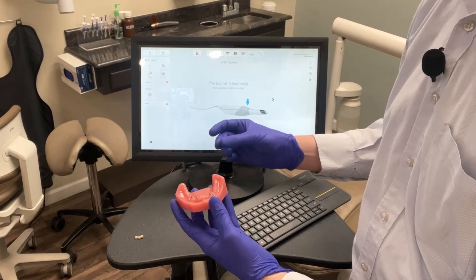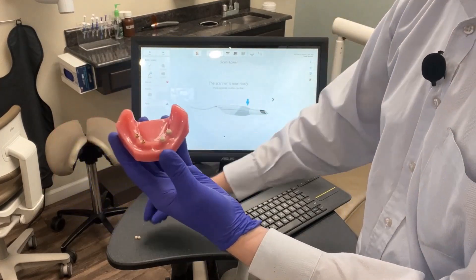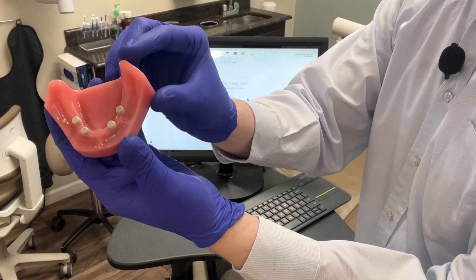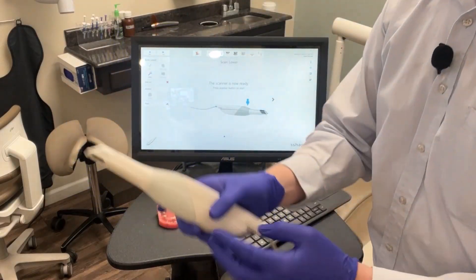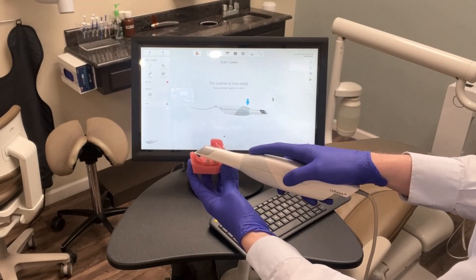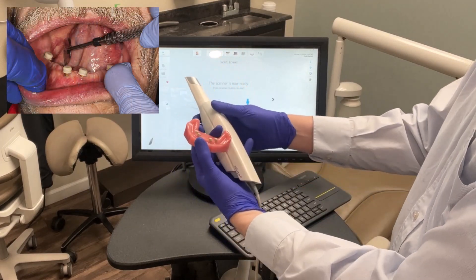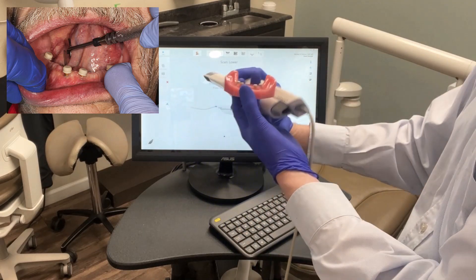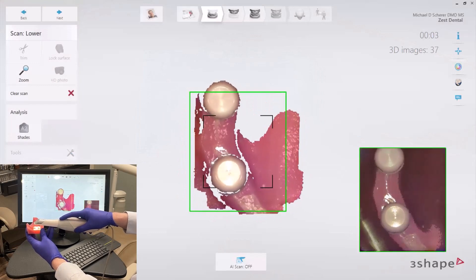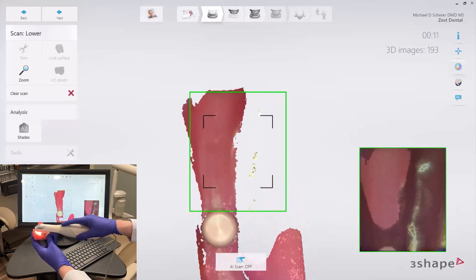I'm going to pop on my locator scan bodies. They don't necessarily need to go on any particular orientation. I'll make sure they're seated down all the way when I'm ready to scan. Now I grab my intraoral scanner and start by scanning the edentulous ridge. Typically, I like to start on the patient's right — I'll take my finger and hold against the cheek, and ask my dental assistant to hold a mouth mirror and hold the tongue back. I'm going to go ahead and start scanning, picking up only the actual locator scan bodies, and then slide back, staying on the edentulous ridge, coming back to the posterior.